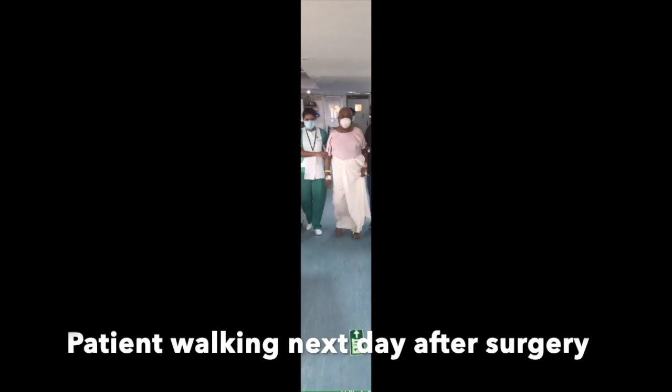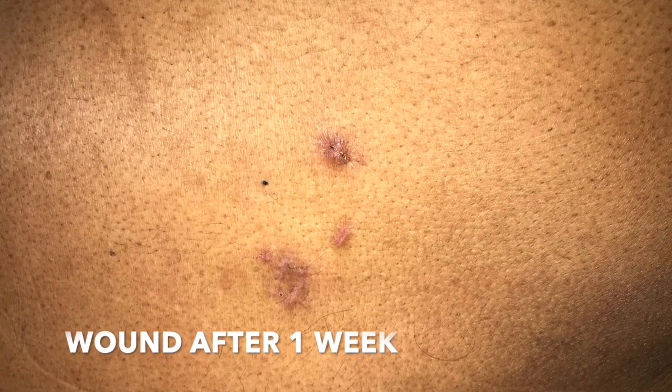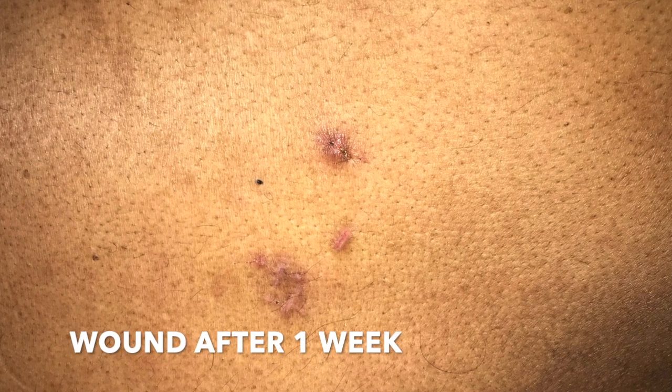The patient was walking the next day after surgery comfortably, without any neurological deficits. The wound at one week later shows only small pinholes at the entry sites.